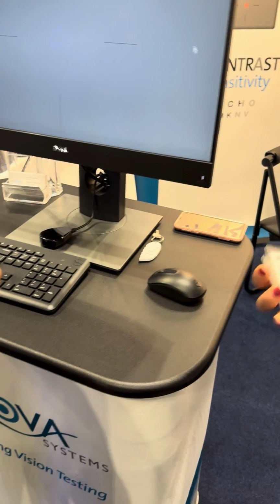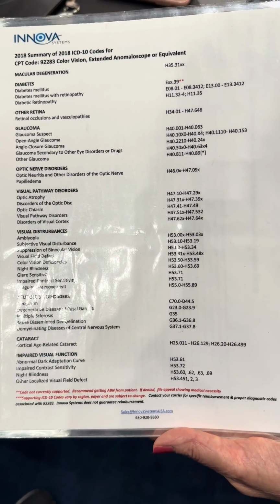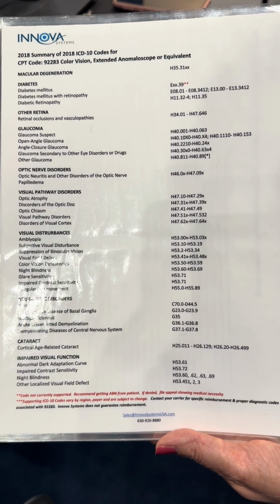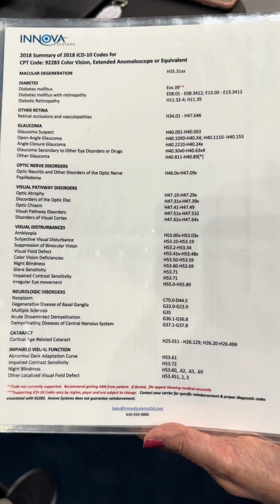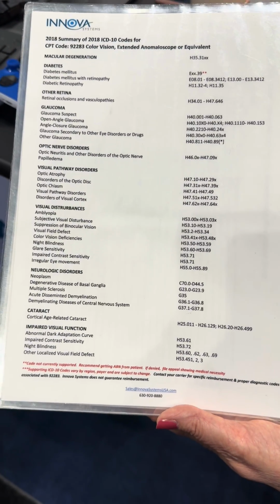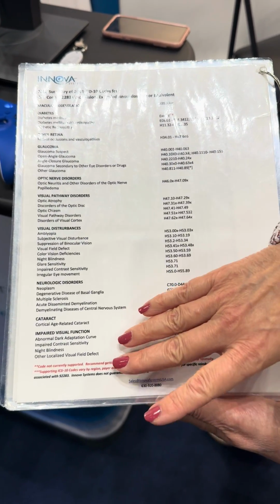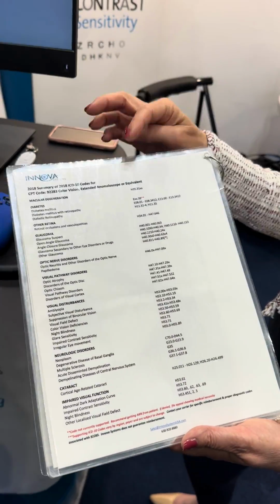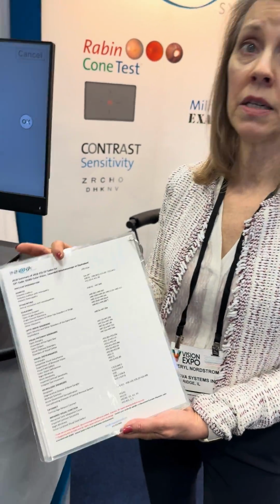So there's many ICD-10 codes with the product, and you can see that anything from macular degeneration, glaucoma suspects, diabetic retinopathy, even cataracts are billable. Also, we can manage high-risk meds like Plaquenil. There are ways that we teach you how to use it for the diabetic eye exam with the visual disturbance and the impaired visual function codes. So there's many ways that you can reimburse, and the average reimbursement for 2024 Medicare is $55. So it's a great reimbursement.